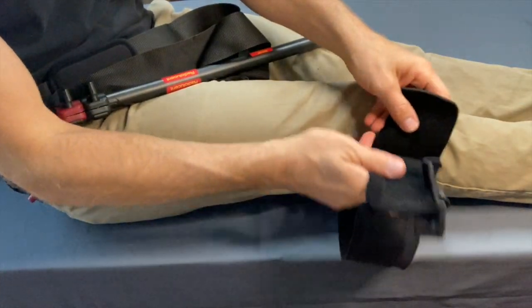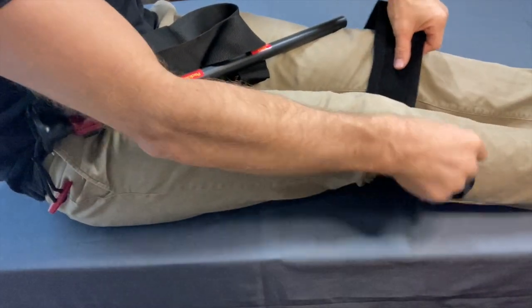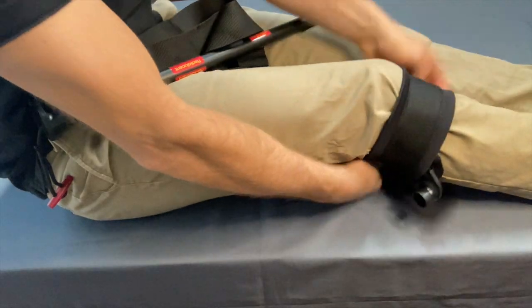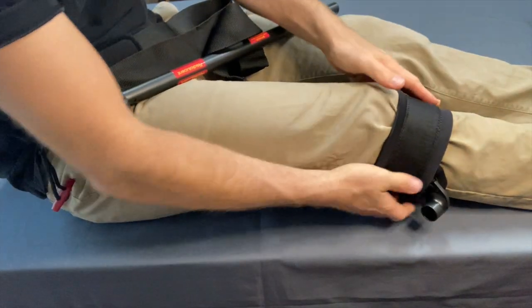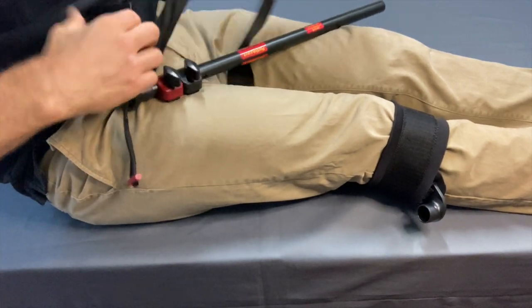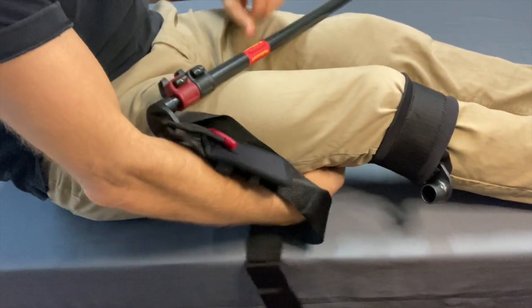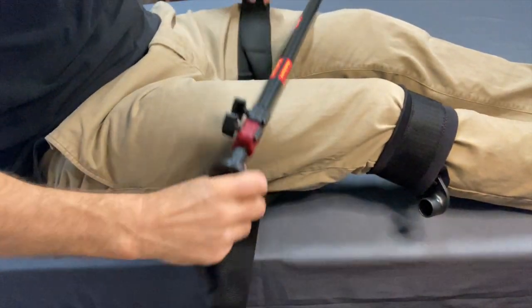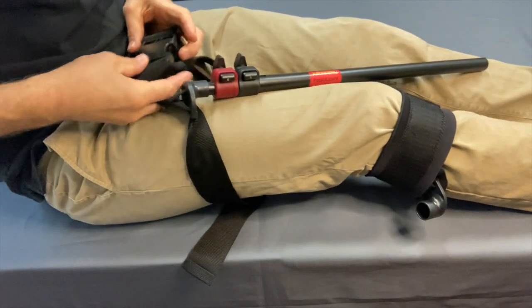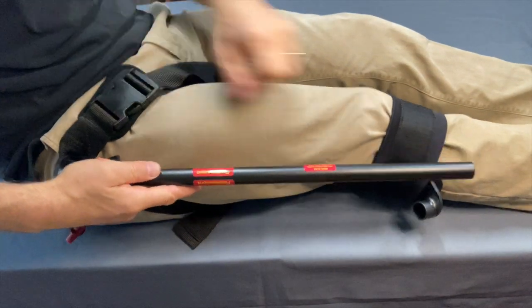The way I do it is I take the distal strap and wrap it proximal to the calf or the patella like this, with the calf still pointing up. Then I take the groin strap, put it behind, and you have a lot of adjustability in length by using the groin strap. If you have a pediatric patient with a short femur, you can make the strap longer.